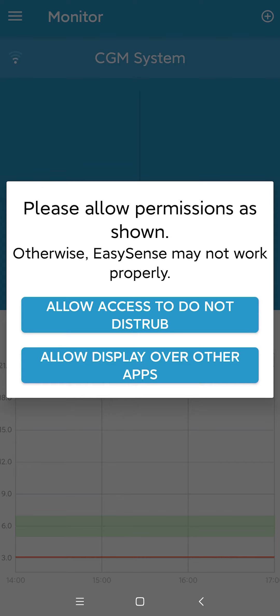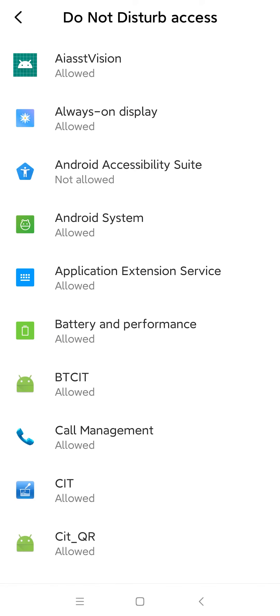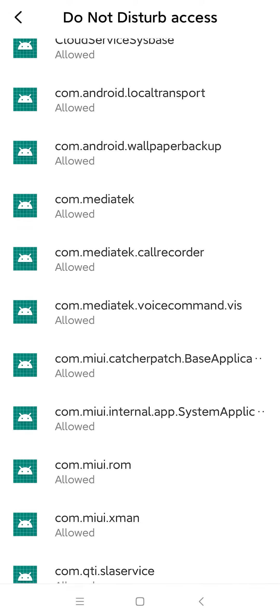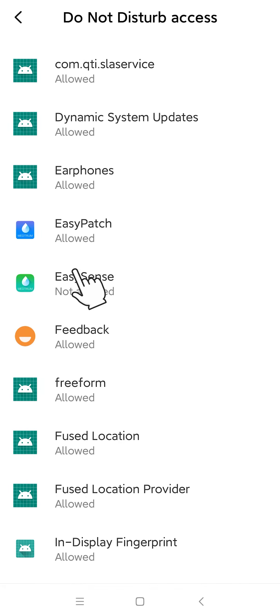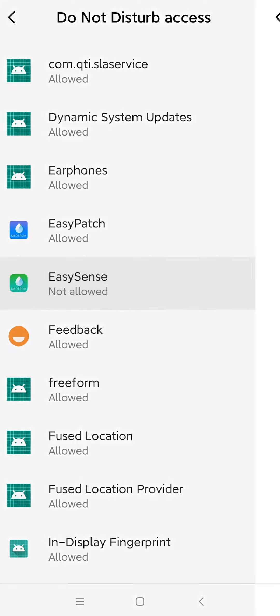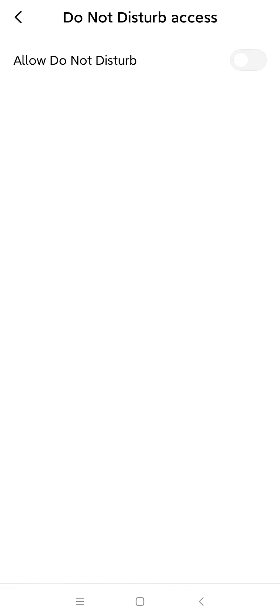On the Do Not Disturb Access page, find and select the EasySense app and switch on the Do Not Disturb option on the following page.